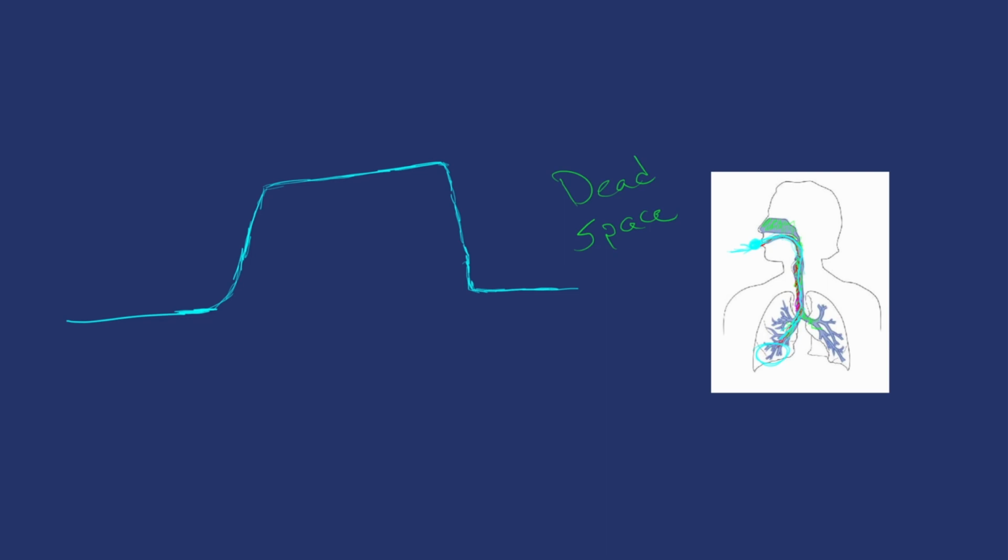So now we can go and step through that respiratory cycle and start labeling this wave for what each part represents. Remember, we had our initial baseline when we're breathing in, and that's going to be stage 1 right here, this first little line. So right here, and we'll just call this baseline. Okay, when nothing is happening or we're breathing in.